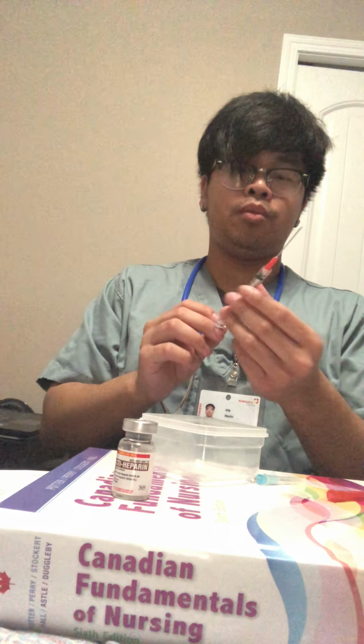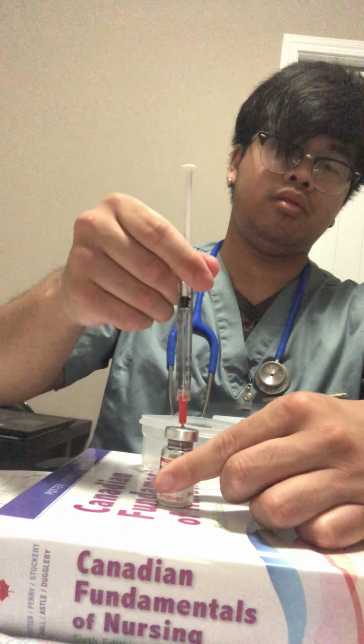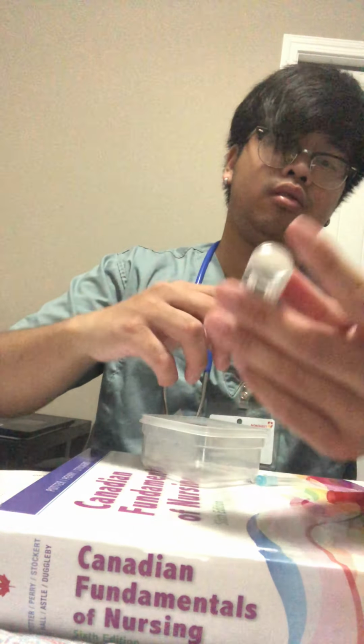I'm going to draw up 1 ml of air, making sure I'm not touching the plunger so I don't contaminate it, and inject it into the vial. Put this upside down.